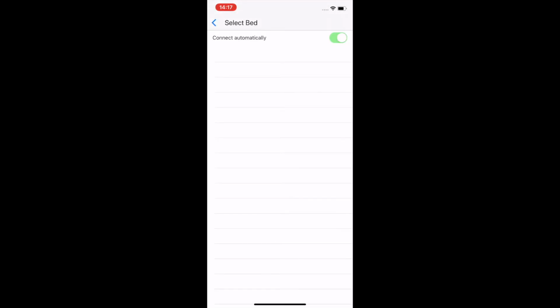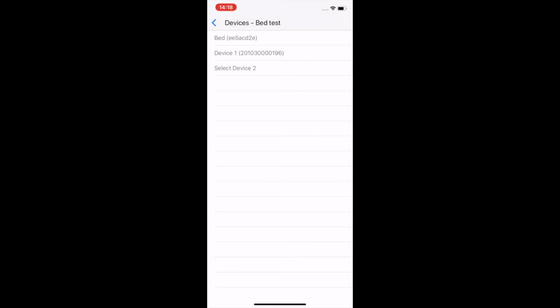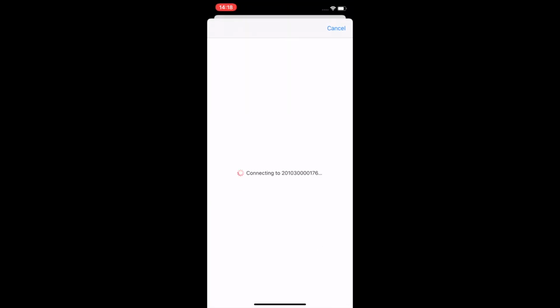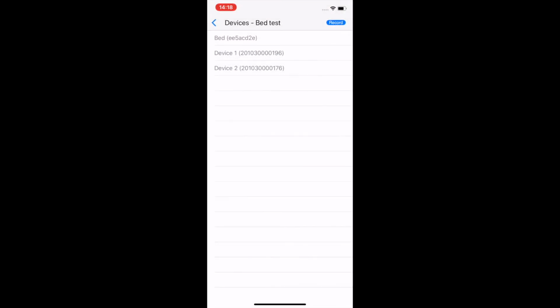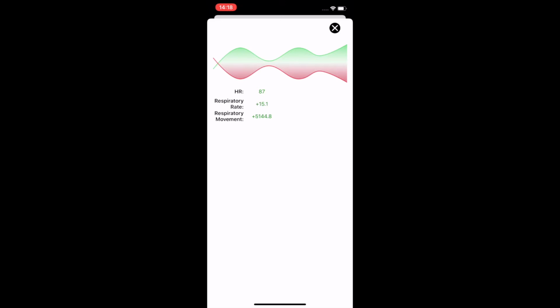We connect the bed sensor. It will pop up and we take it there, and now it's connected already. We take the next one of the Movesense sensors, where we have also added acceleration and gyroscope in addition to the two temperature sensors. We take the second pad and add it also to the data collection. All data is synchronized as always, and as soon as we have them all connected and press record, you actually see the data that we get from the sleep sensor.